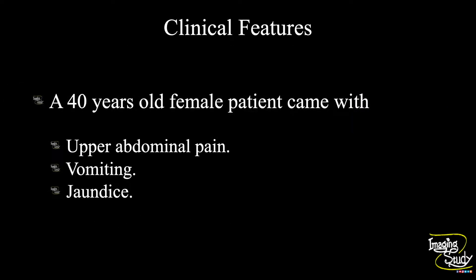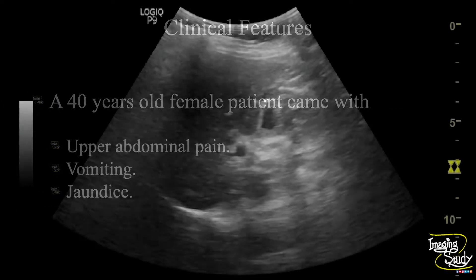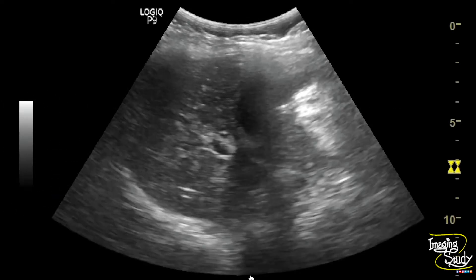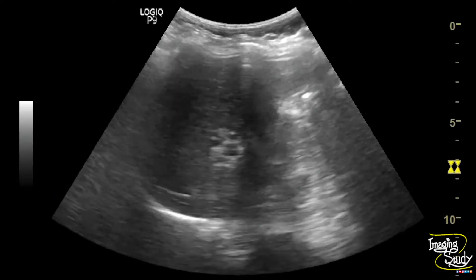A 40-year-old female patient came with upper abdominal pain, vomiting, and jaundice. This patient came in at 2 a.m. midnight. Let's see what we have got on ultrasound.